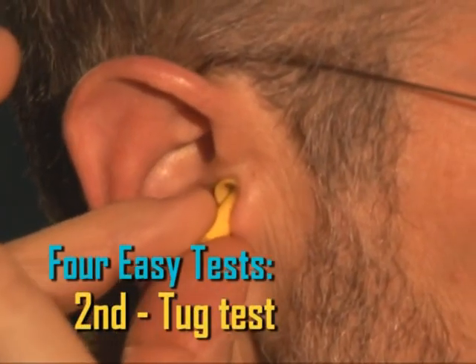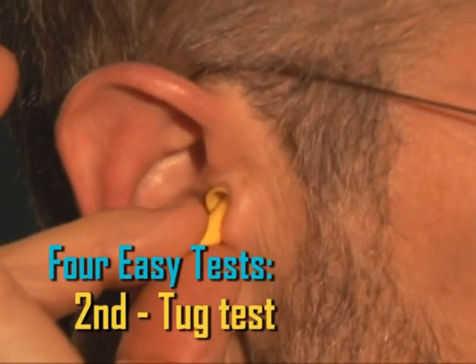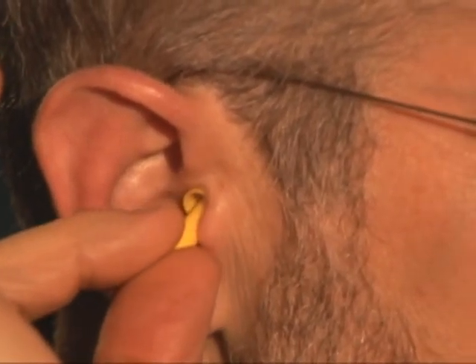You can also compare the sound of your voice between the 2 ears to make sure it is balanced and appears to be in the center of your head, indicating that both plugs are fit the same. The next 2 tests, the tug test and the pump test, rely on the fact that for a plug to be well fitted, it must make an airtight seal within the ear canal. So for example, if you try and remove the plug by gently tugging on it, you will notice that there is resistance as if you were trying to remove a stopper from a bottle. If the plug easily slides out of the ear without any resistance, then that's an indication that the plug was probably not sealed.